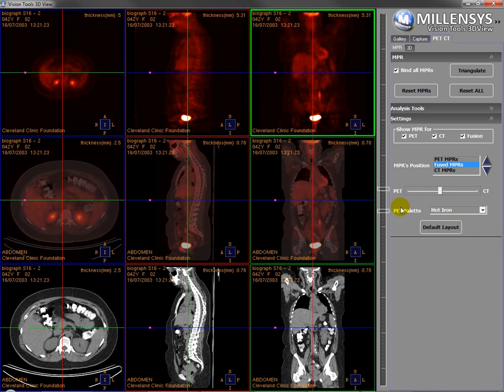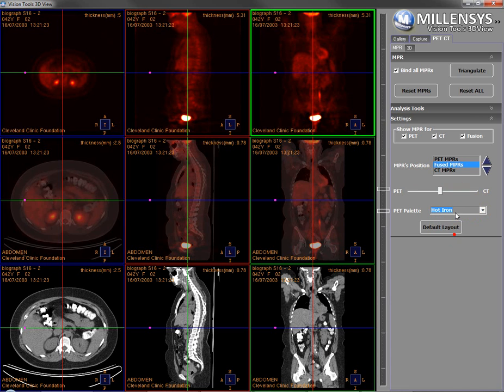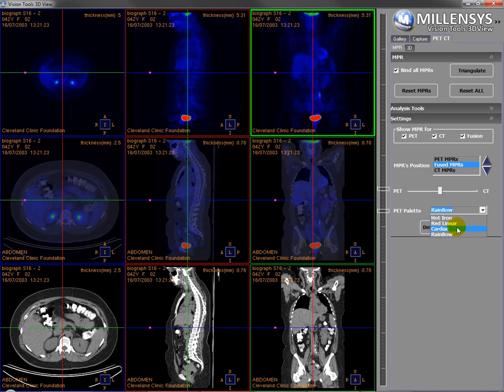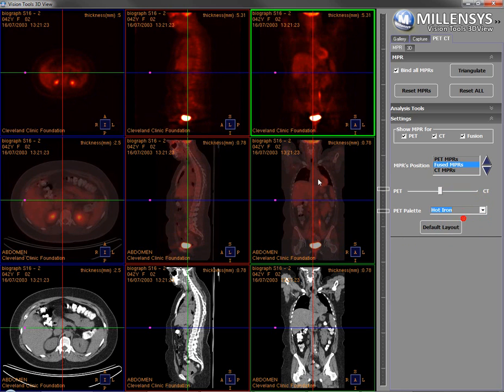I can change the color palette of the PET, like this.